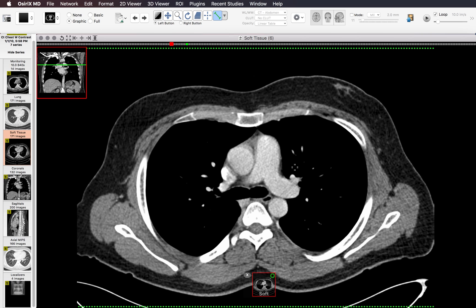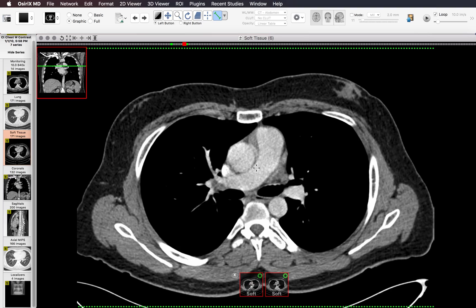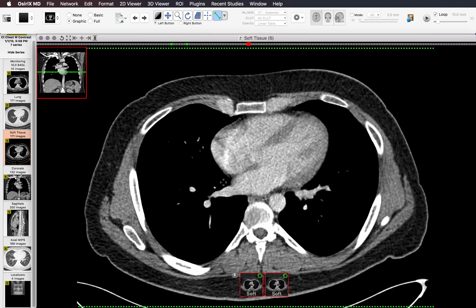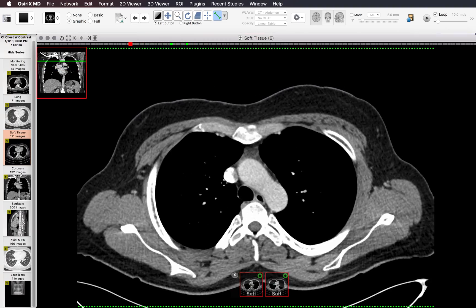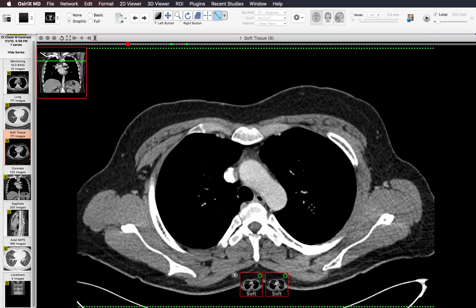Then I look at the heart and great vessels, measuring them with the measuring tool. I measure the pulmonary artery orthogonal to the long axis — that's 28 millimeters — and the aorta, which is 33 millimeters. I use about 30 millimeters for the pulmonary artery and 40 millimeters for the aorta, but you should follow your own institutional guidelines. Since this is a chest CT with contrast, I also look inside the pulmonary arteries, following each lobar and segmental artery out to make sure there are no filling defects, because occasionally you will find incidental pulmonary emboli.